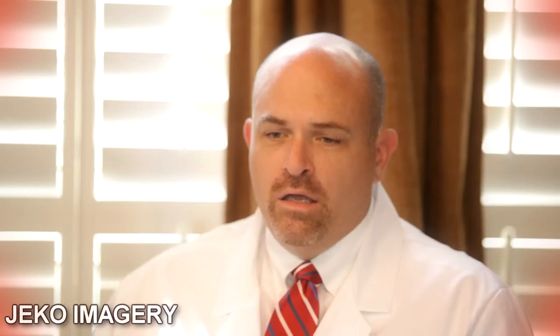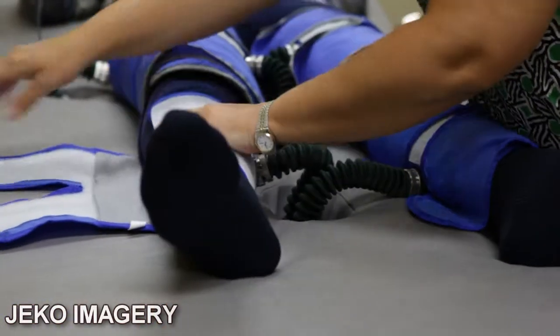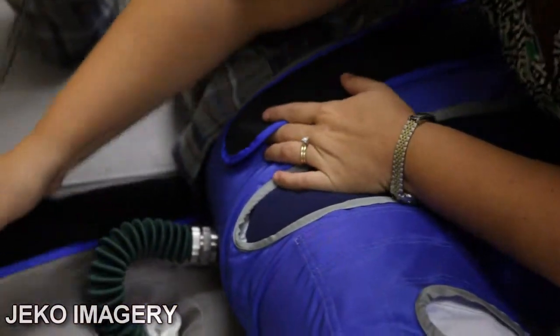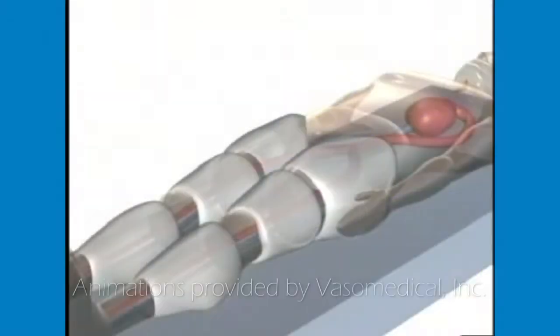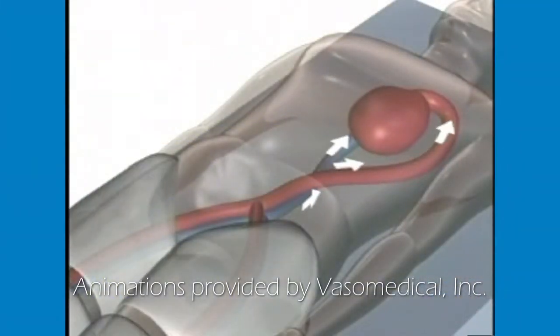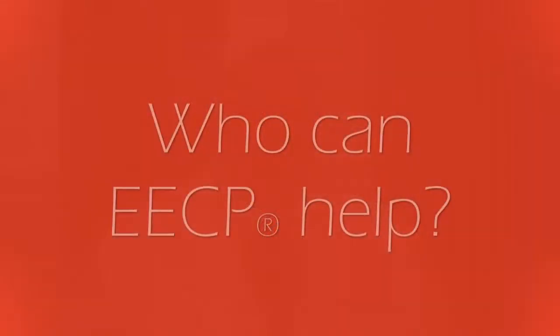Hi, I'm Greg Brewer. I'm an interventional cardiologist. I've worked in Knoxville for 16 years. Enhanced external counterpulsation is a technology that's been around for almost 50 years. What it is, we strap these blood pressure cuffs, placed on the thigh, on the calf area, and in the buttocks area, and the legs are squeezed to the rhythm of the heartbeat. It helps unload the heart so that it can pump more easily, but also creates a back pressure so that the perfusion is increased during the cardiac cycle when most perfusion occurs.